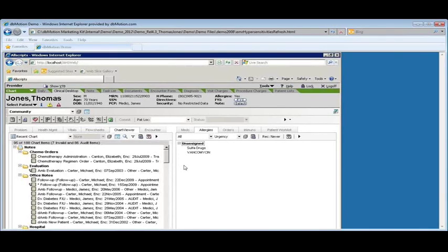So we don't have to do one to many and then many back to one. We only take many to one, and then we could translate it to any language we want. So that viewing of the data, that vocabulary is done on the fly. So it's local, baseline, local, all done on the fly, and that's how we can do it in this sub 5 seconds kind of way.